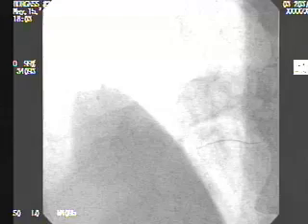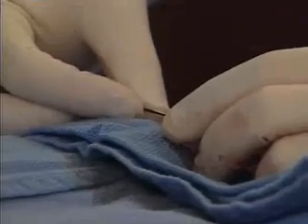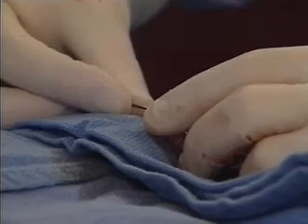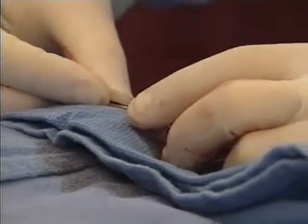What do you think, Bill? We're going to take a picture with the stent. You can see the stent right now. It's the two markers. The stent sits between the two markers. We're going to document with a picture with a little dye if we have it in good position. Can we see the fluoro there? And let's... Okay, do you want to flush a little more dye, please?